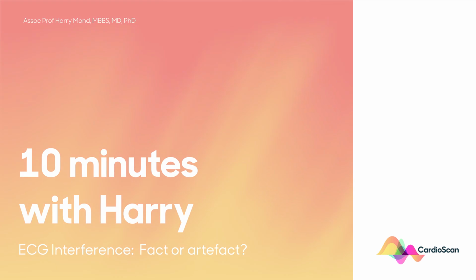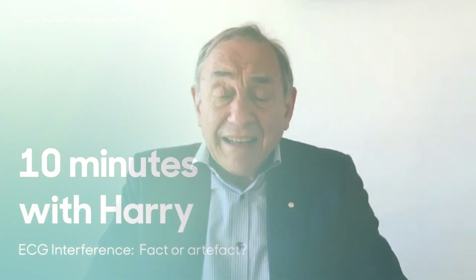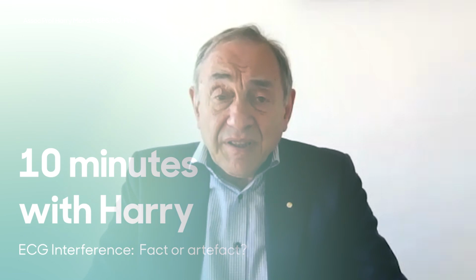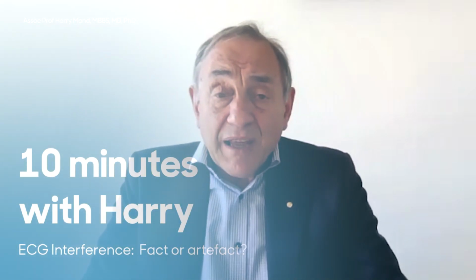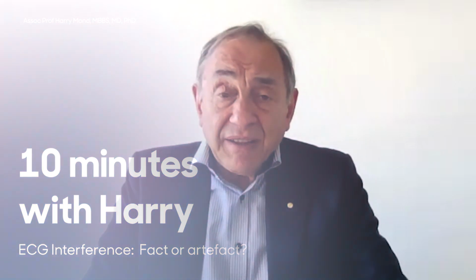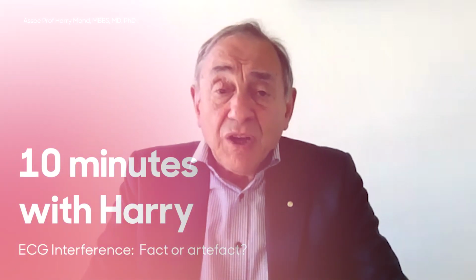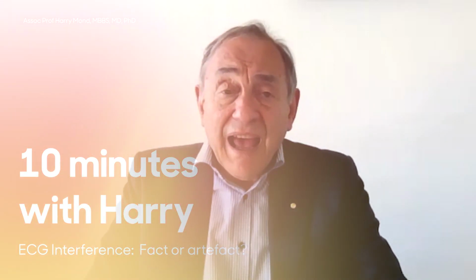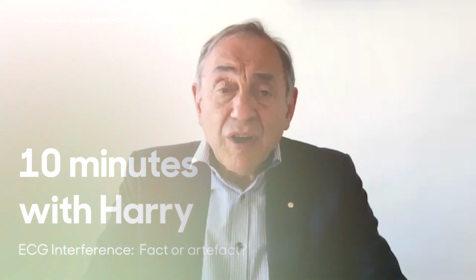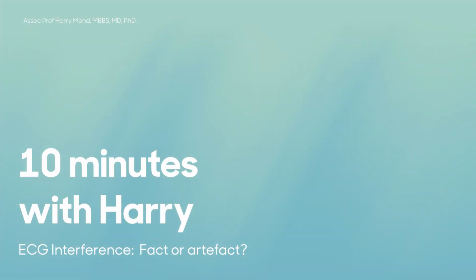On a previous presentation, I showed ECG artifact or interference, the reasons why it occurs, how we can recognize it and how to prevent it. Today, I would like to spend time with you talking about how the ECG artifact can be misinterpreted and create problems for the person reviewing it, resulting in a misdiagnosis.